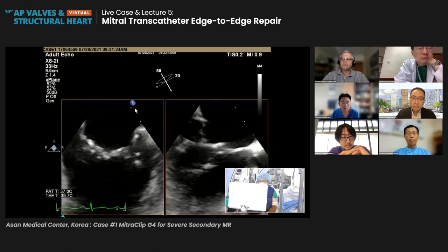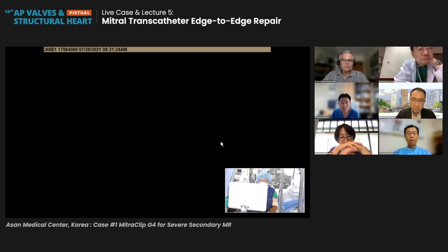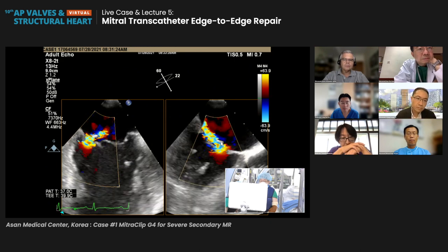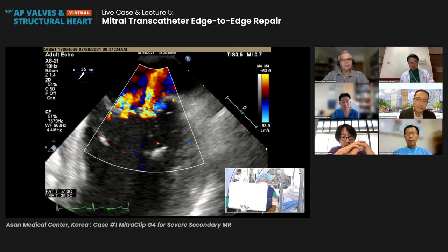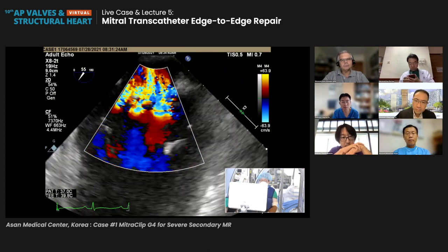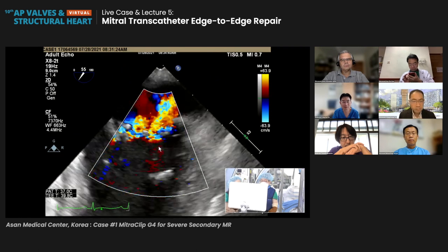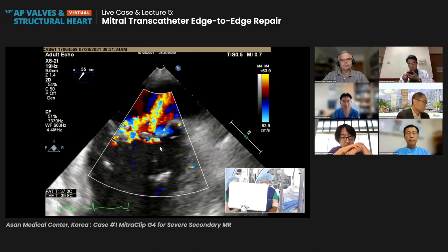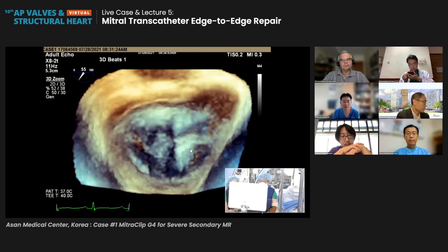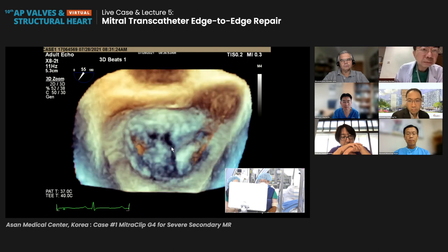In the long-axis view, you can clearly see a big coaptation gap in the A3 chordal rupture area and a second ruptured chorda. Severe MR jet here, and the PISA radius was 10 millimeters at 40 centimeters per second aliasing velocity, indicating severe MR. However, the problem is the patient had multiple functional MR jets everywhere, here and here. In heart team discussion, we initially recommended mitral valve surgery for her, but she refused the surgery. That's the problem; we have the MitraClip right now. In the 3D image, you can see the A3 prolapse and chordal rupture here, and then this seems like a cleft, but in the color flow image.